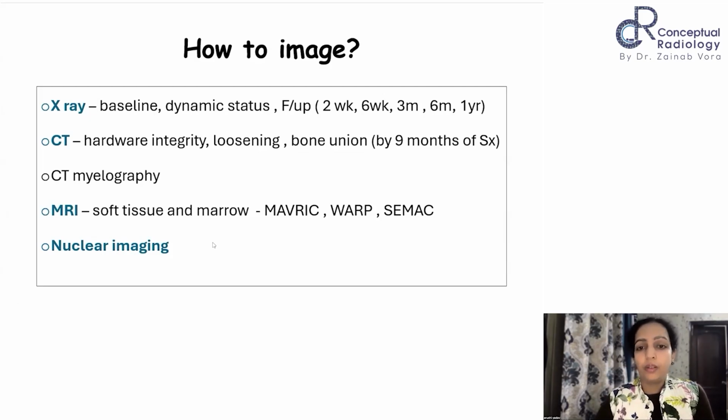Then nuclear imaging, right? Nuclear imaging is also deployed at times as and when needed.